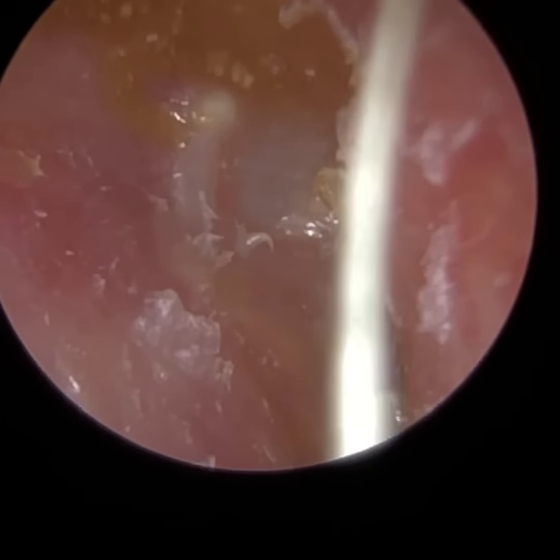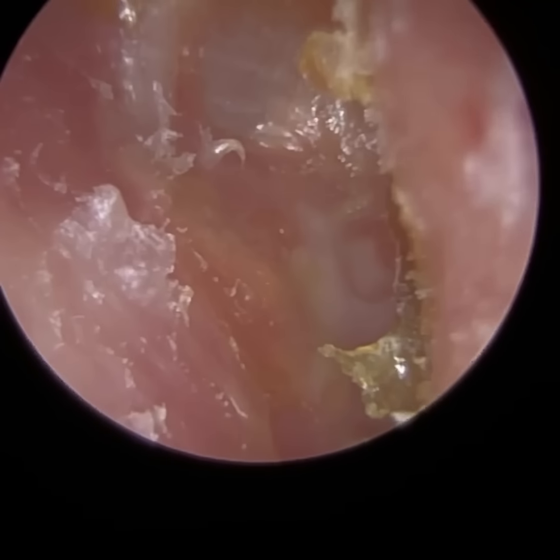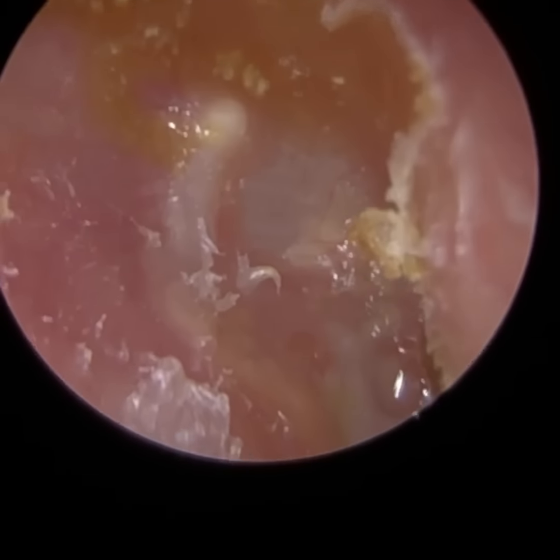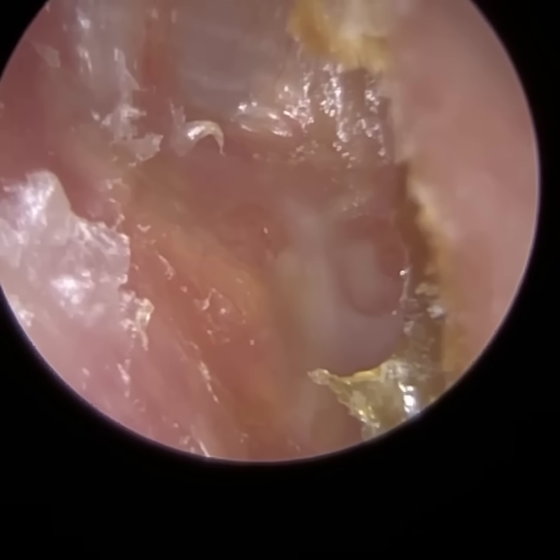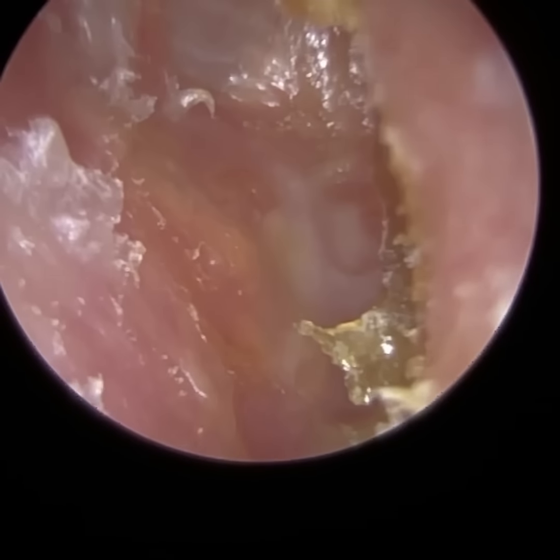And the skin migration starts from the centre of the eardrum. So if you've been watching my videos in the past, I've always compared the eardrum to a pond. And then if you put a pebble right in the middle of the pond, you get the ripple effects. And think about the ripples as being dead skin that's moving sideways out of the eardrum, onto the ear canal and out of the ear.